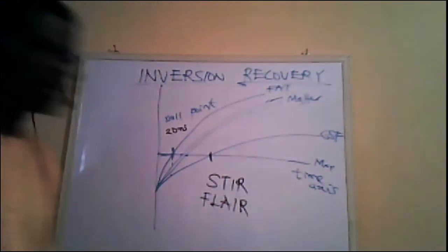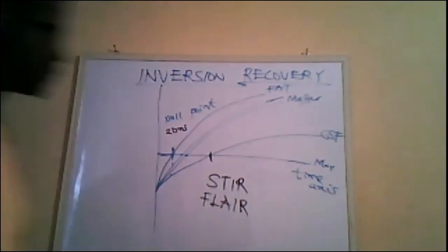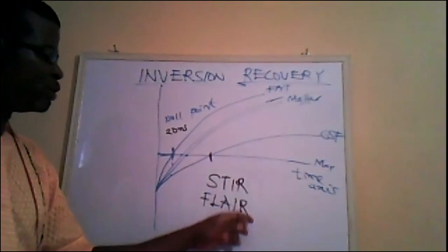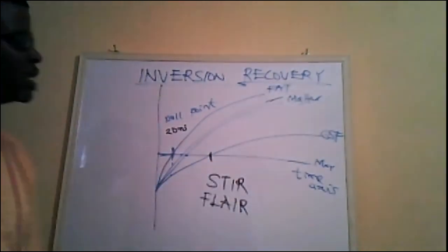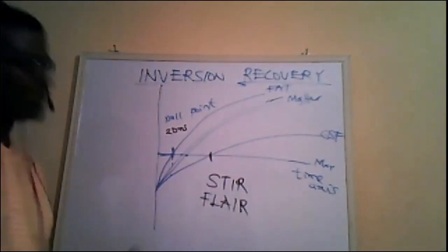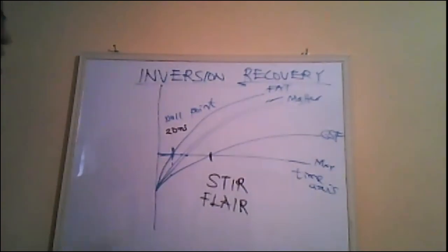Of course, these two are available on all MRI scanners. This is a fluid attenuated inversion recovery because the fluid content is mainly water. So if we now null it, if we apply the 90-degree pulse at this point, we are going to have a FLAIR image.